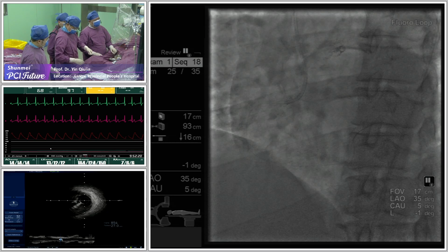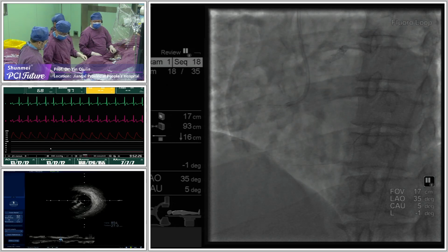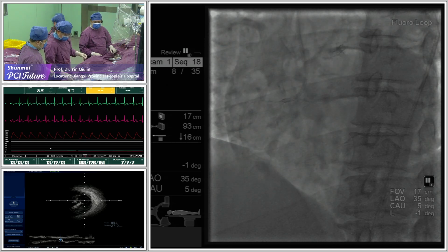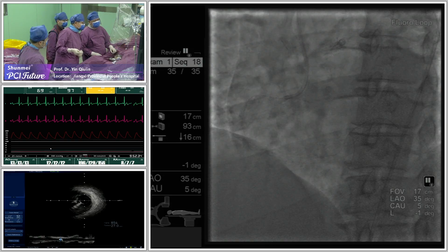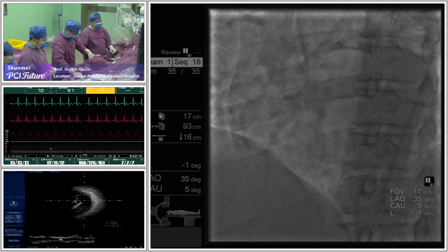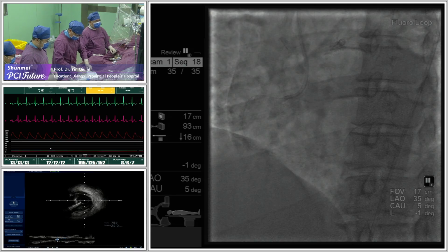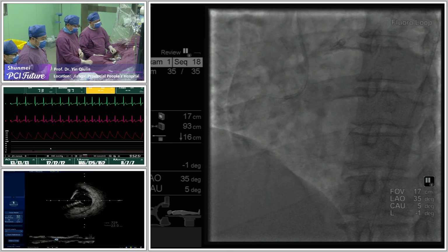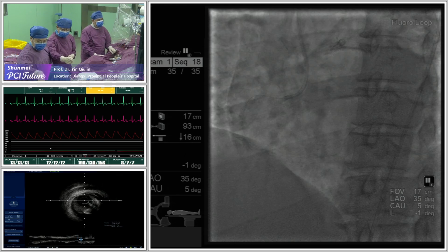After the XTA, is the next one. Professor Yang, can I say that again slowly? Yes. Alex's question is, why are you trying to cross through to true retrograde rather than perform reverse CART? No, I'm not trying to do true. I know that antegrade is in the subintimal space, definitely. So I just want to manipulate the retrograde wire to the same space. True lumen is okay, but false lumen is also okay.